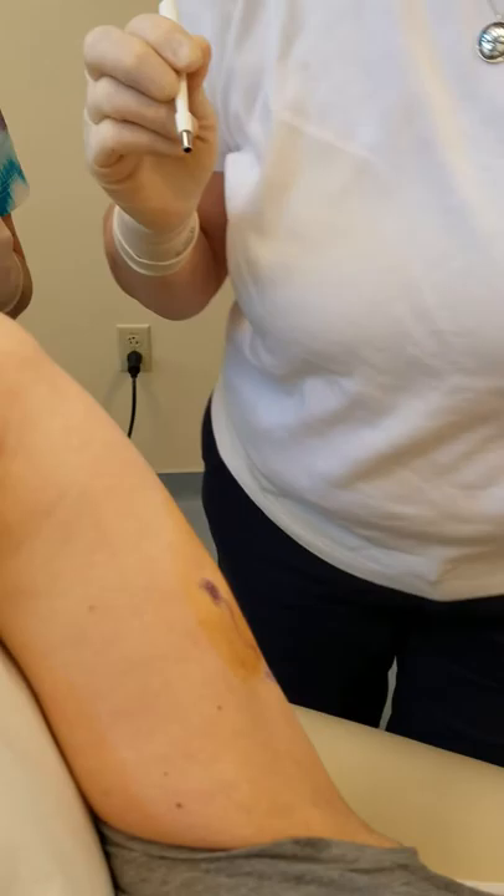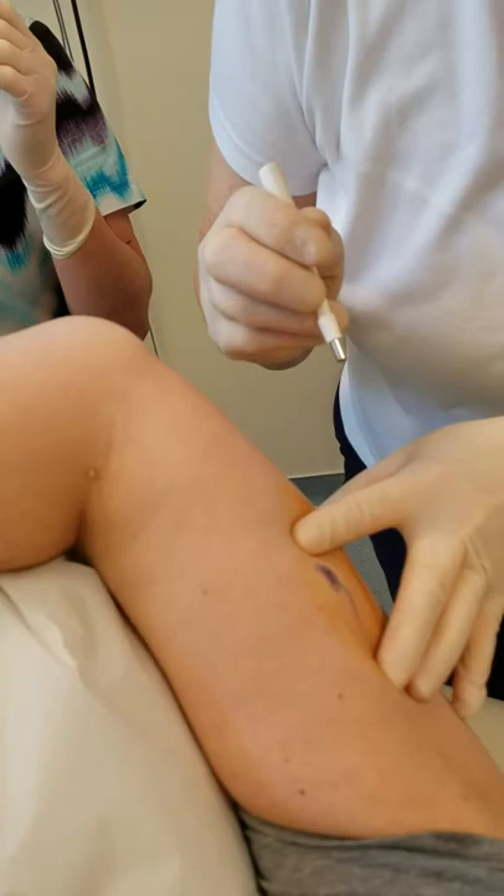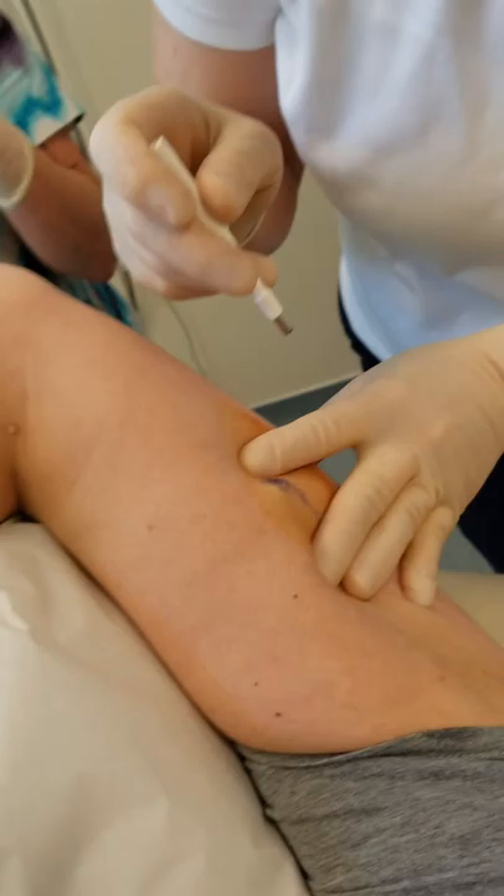We have prepped this here with Povidone. We do wipe that off because otherwise you can tend to tattoo your patient, which is not usually the desired outcome. What I'm doing here is palpating the proximal end of this Nexplanon, and as you can see, like most of them, they come up almost like a little splinter.